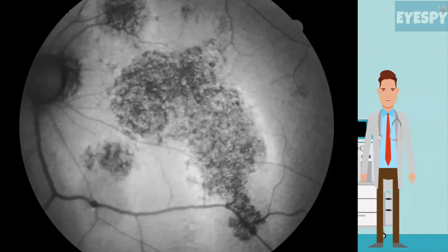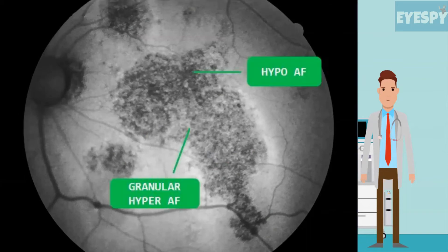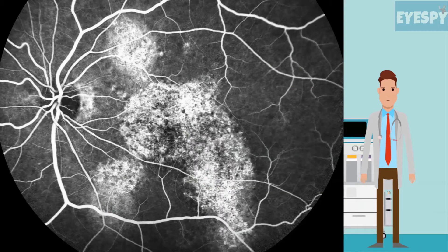FAF is a non-invasive modality used to assess the function of RPE in CSCR. This patient shows hypoautofluorescence in areas of RPE atrophy and granular hyperautofluorescence in areas of elongated photoreceptor outer segments.